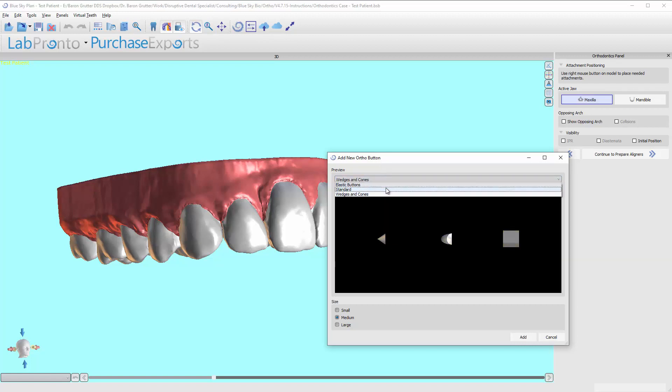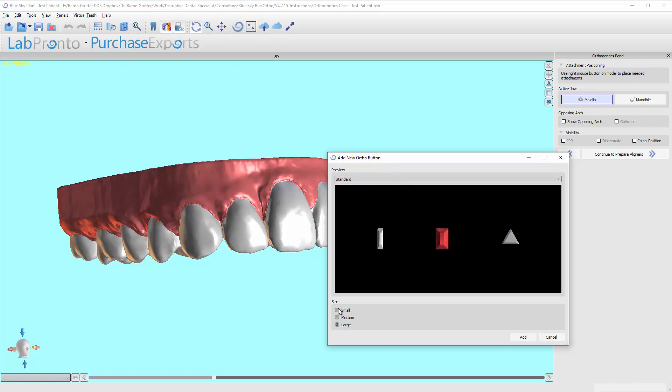My go-to is the standard rectangle. I usually set it to large. You can set them small, medium or large. You can scale it later, but for now I just always pick large.